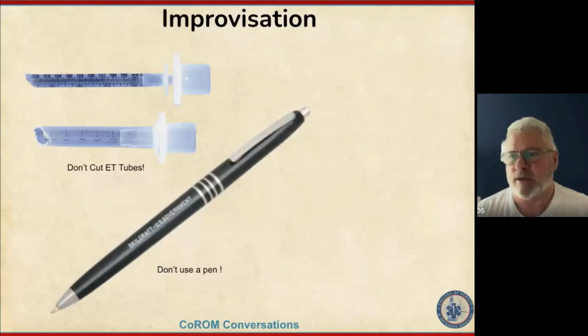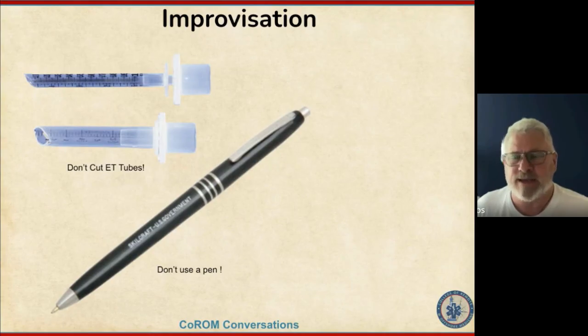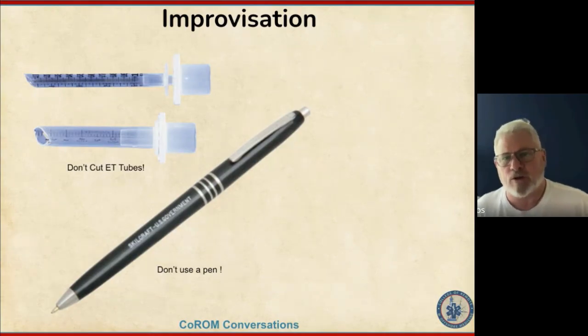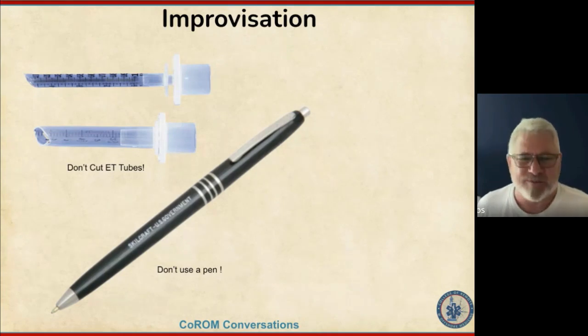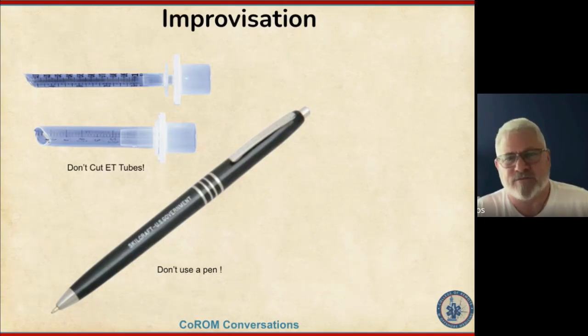You could put an airway in, but if you don't have the ability to supplement their oxygen to make it more effective, so that whatever is getting in there is carrying a greater concentration of oxygen, that'll help too. But it's a Band-Aid for a situation. If the airway's too small, looking at the pen, everyone thinks the middle of the pen is what they're breathing through. But if you look down where the silver end is, that's what they're actually breathing through. So it's not realistic. There's no way you're going to sit there and breathe through that for any length of time.